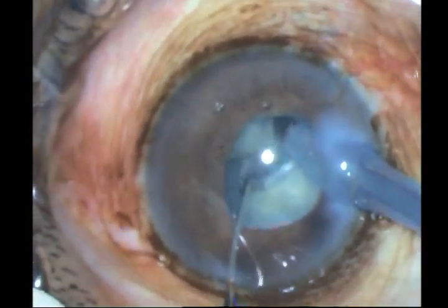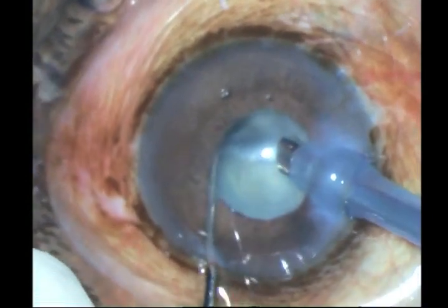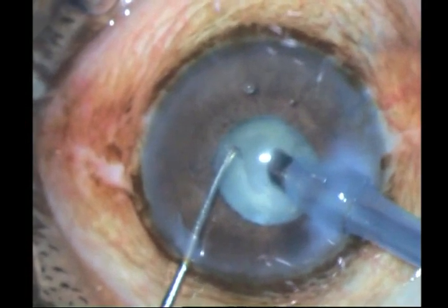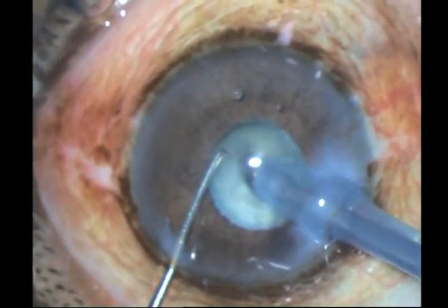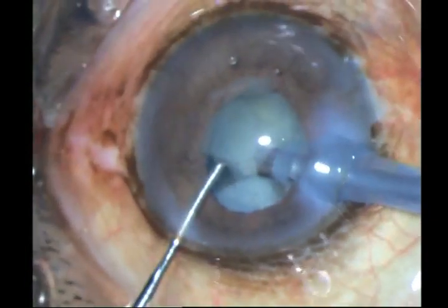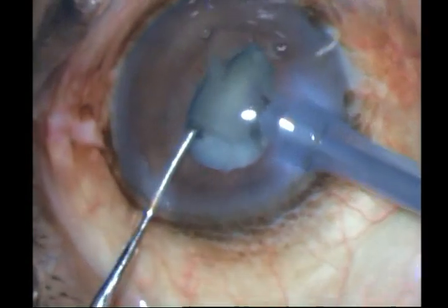because that would shut down your pupil even more. Always stay right in the center of the pupil. Don't come backwards or forwards, because once you catch this iris, then it's going to be a different story altogether.